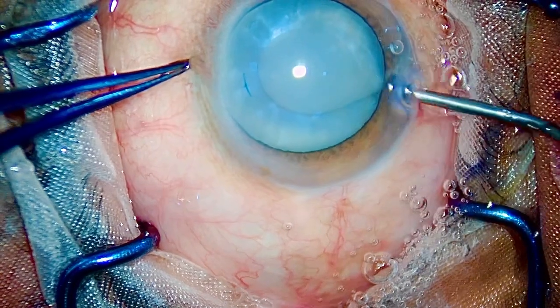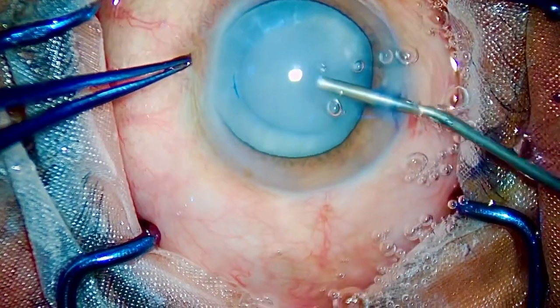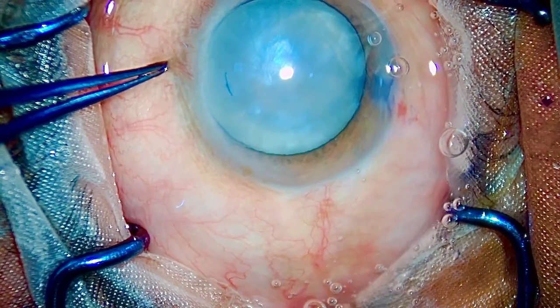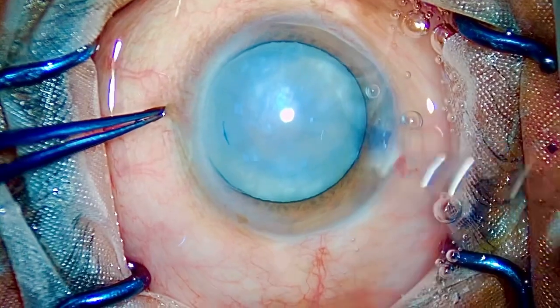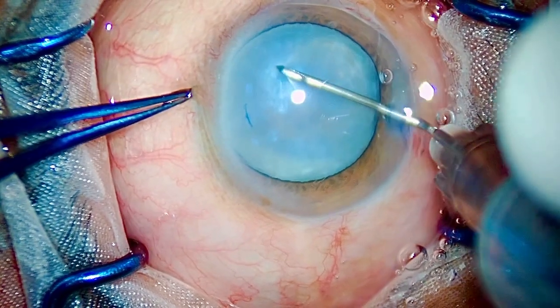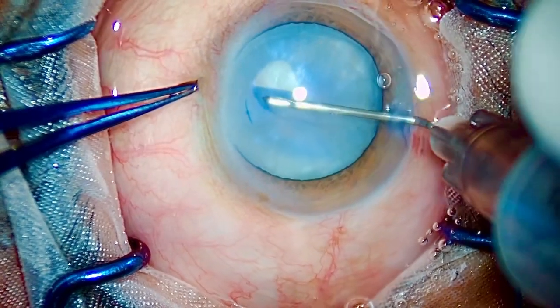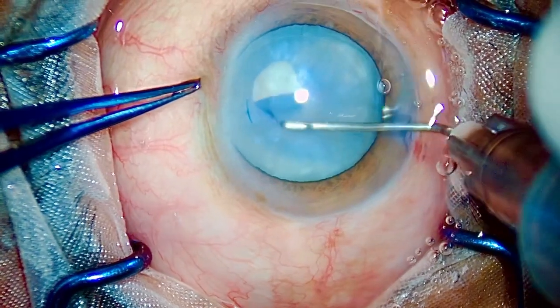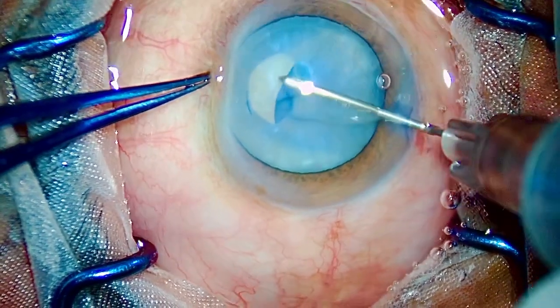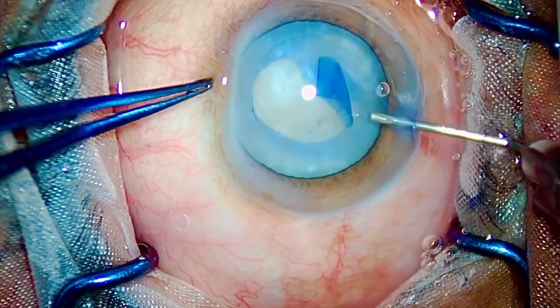As I have started this hypermature cataract, I want to give you some pearls of wisdom — great tips for cases like these. Tip number one: never, ever keep the anterior chamber shallow in these patients. As soon as I noticed this liquefied cortex coming out of the bag, I injected some Visco and pushed the bag down to the iris plane. I am not in the habit of using Rexes forceps, but I have asked my OT assistant to keep it on standby in case I have to salvage a Rexes runout situation.